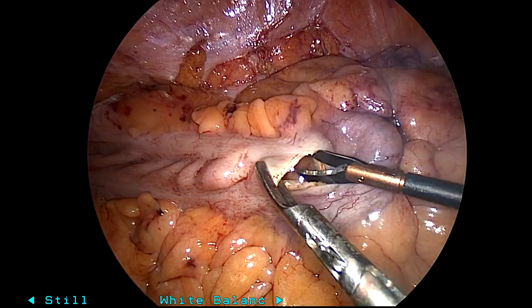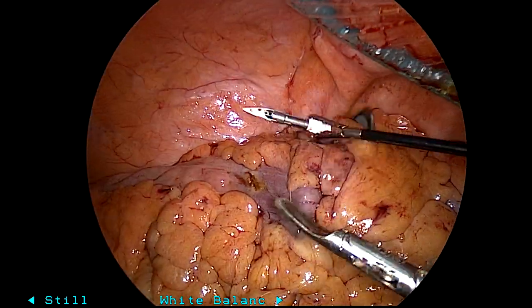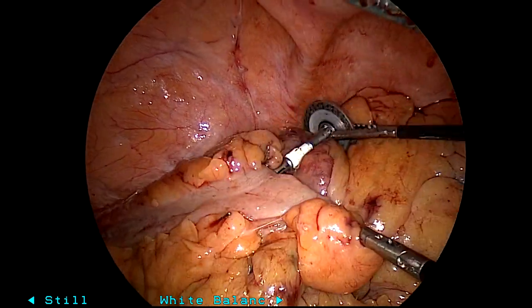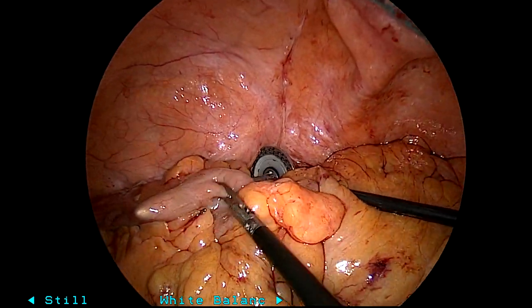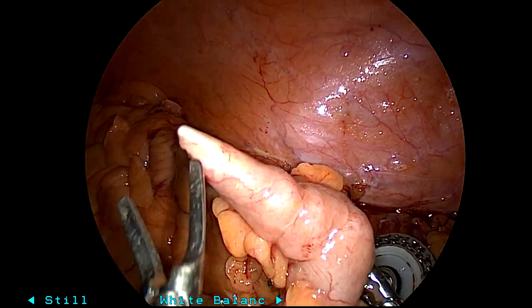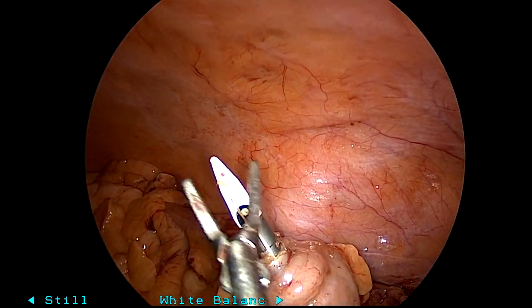Given how big the bowel was and how thick his abdominal wall was, I didn't want to have to extracorporealize the bowel to place the anvil. And due to speed purposes, I was not going to do a hand-sewn anastomosis in this case. I'm just showing my preferred method of doing this.